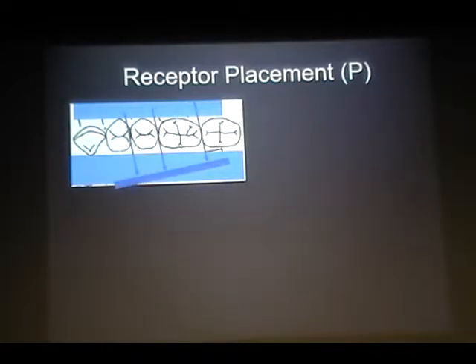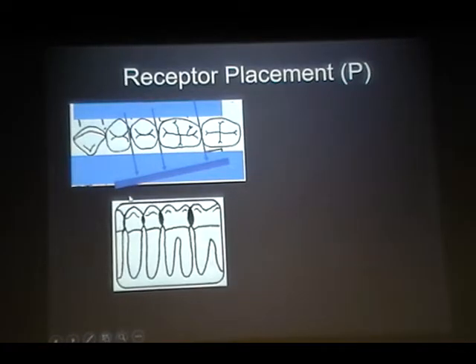So please make sure that, imagine these are the patient's teeth, when you place the receptor, it's parallel, not like this. And three things have to be parallel, right? One, the teeth, the receptor, and the X-ray beams that are coming have to pass through those interproximal regions. If you see at this projection, they are not straight on. So you will end up getting something like this. These are not open contacts. They are closed, so you cannot get any information.